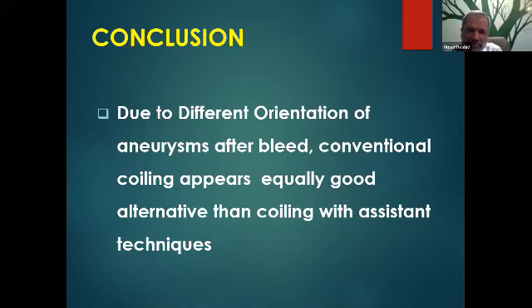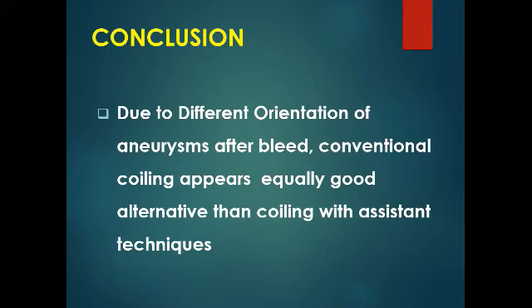It's very convincing, your scope and your belief about the usage of simple coiling as the first option in all cases, and you must keep to simplicity for treating any aneurysm until the situation forces you to use other devices like stent assisted, balloon assisted, or even flow diverter. I think this is a very important message that we should disseminate: you should firstly start with a simple way of thinking, and you guard this simplicity until you realize that it is not working in your case.